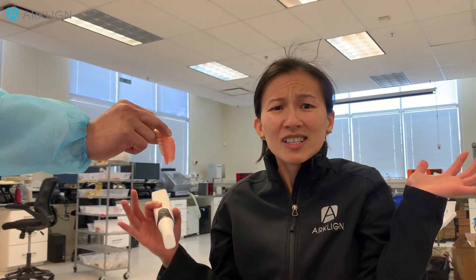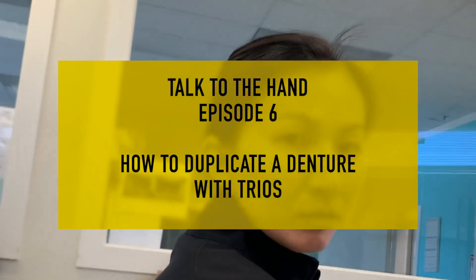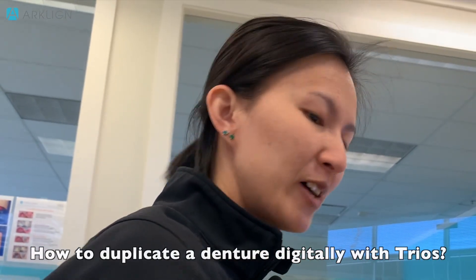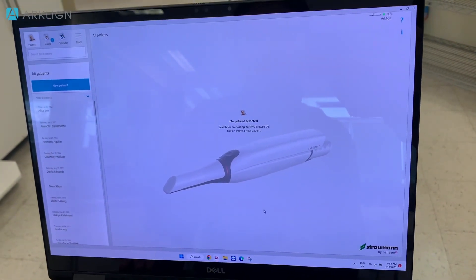Duplicate this! How to do a duplicate denture with a Trio. Okay, let me show you how. Right now we're going to show you how to do a duplicate denture with a Trio scanner.